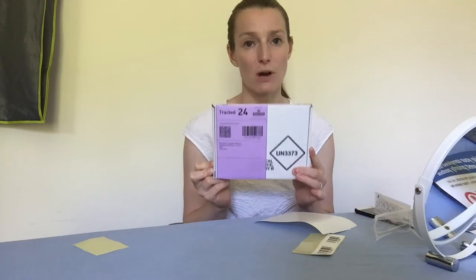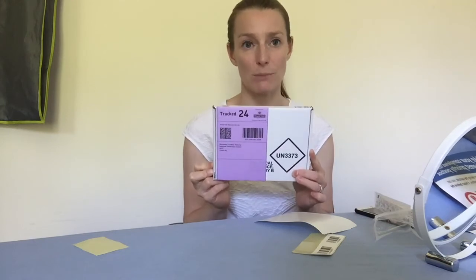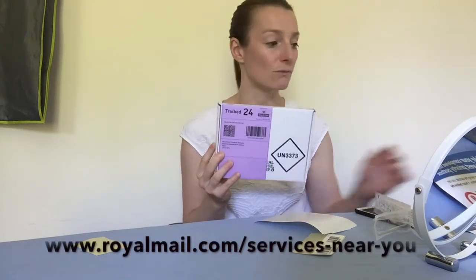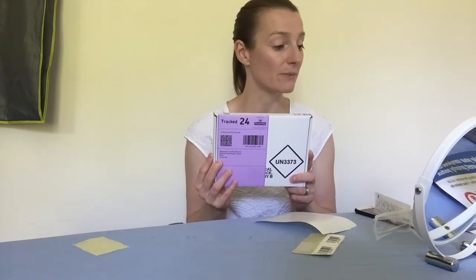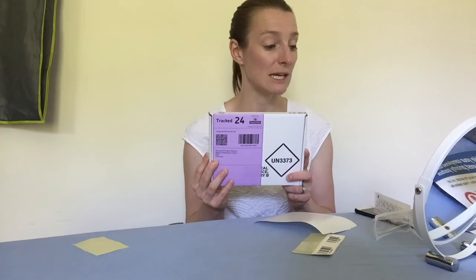The important thing is that you find a priority post box — it can't go in any post box. You have to go online onto the Royal Mail website, I think it's royalmail.com/services-near-you, and look for a priority post box. You will then get your test results by text message and email, depending on what information you've given them. The test results take two to three days to come in.